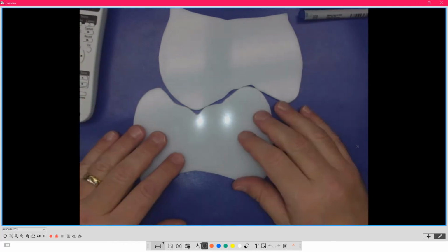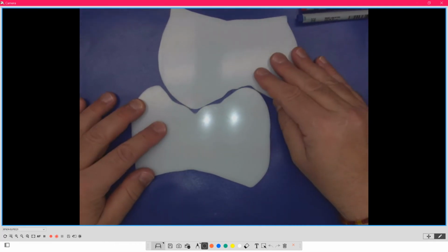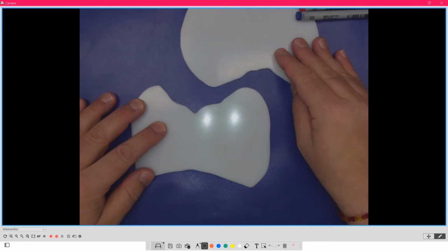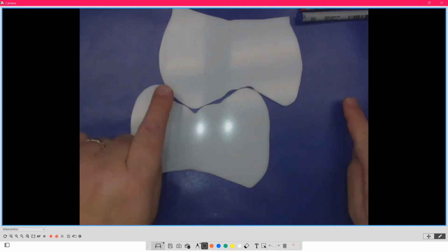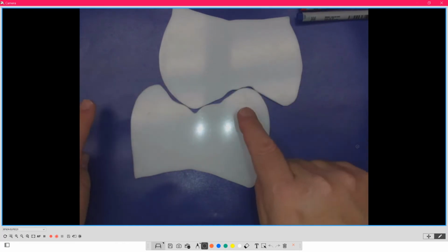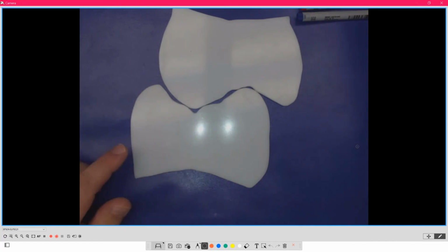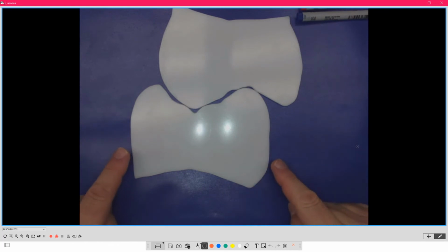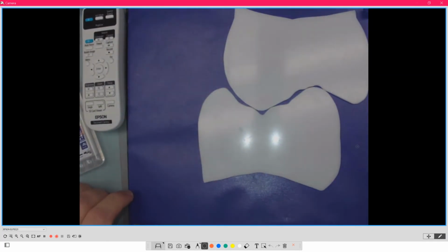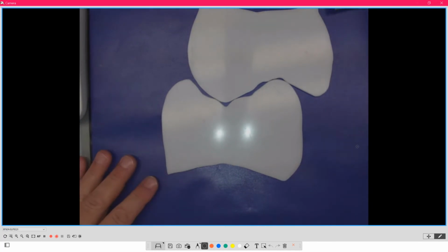Okay, so remember, let's look at this. I want you to pretend these are 20-degree teeth. 20-degree teeth operate so that everything has to touch, come through, land, and touch, and it's doing it bilaterally. So both have to do this at the same time, touch at the same time, in the same manner in someone's mouth for it to work. We do it on an articulator, yeah, but now I'm talking someone's mouth. It's impossible, not going to happen. And that's why I banged my head on that wall over there for so long, going, what am I missing here? Because I'd remount it and it would always have that same result.